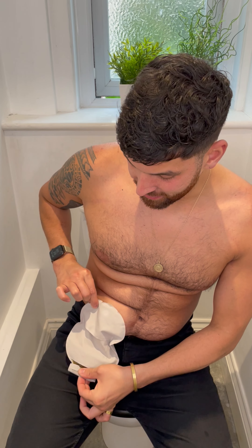My name is Misha, I am the face behind Mr. Colitis Crohn's, and a lot of you may recognize me from my bag and my shorter form content where I changed my bag in under 15 seconds. However today I'm going to slow that process down, show you each segment of me changing my bag, show you what's under this bag, and just give you some tips and tricks along the way.